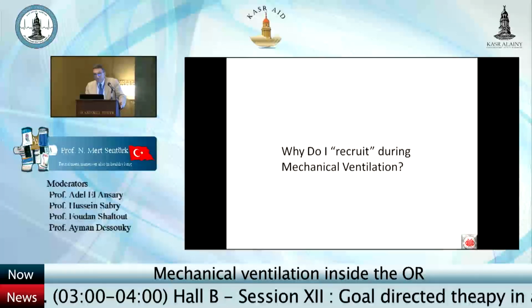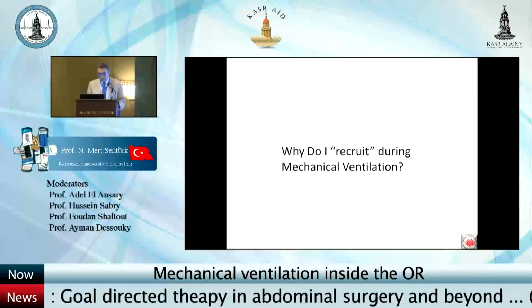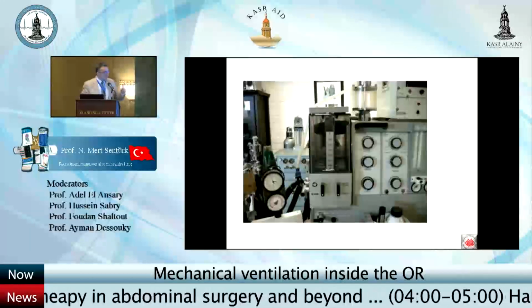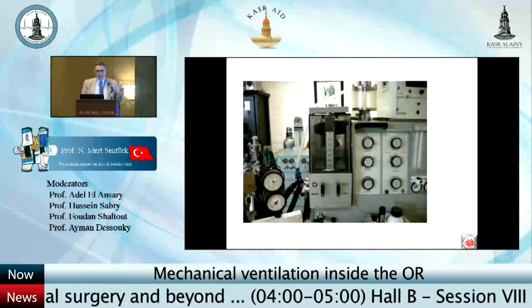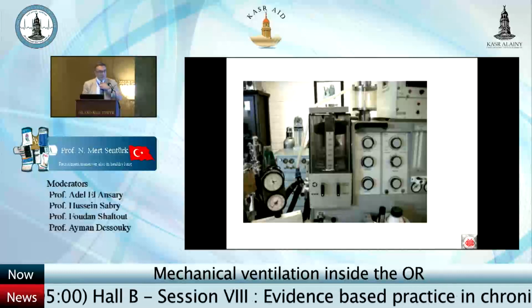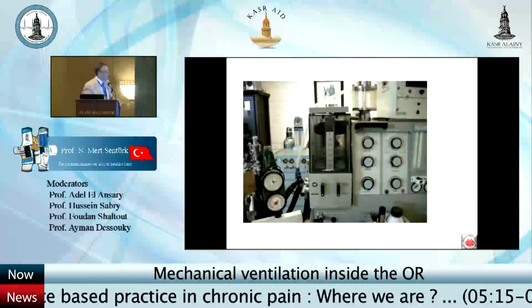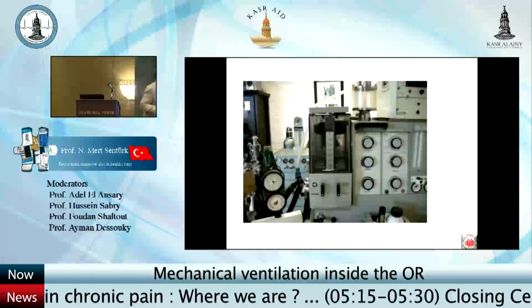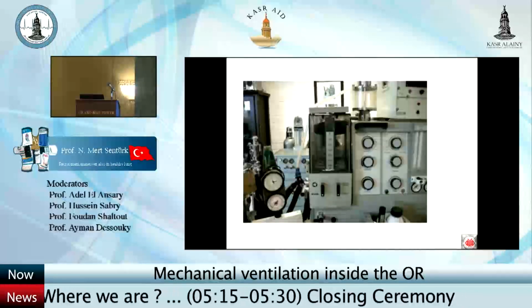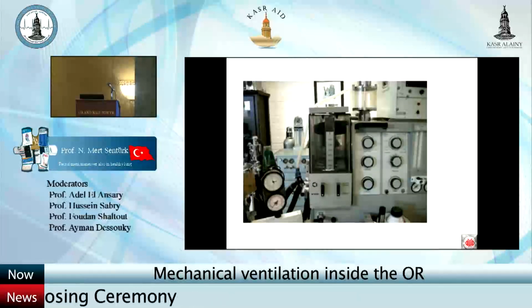Because we already mentioned that mechanical ventilation is an unphysiologic process. This is again a historical anesthesia machine from my starting periods. Unfortunately, it is not my own photo, and I found it on the internet. And on this machine, there's a knob. Over the knob, you can see "sigh".